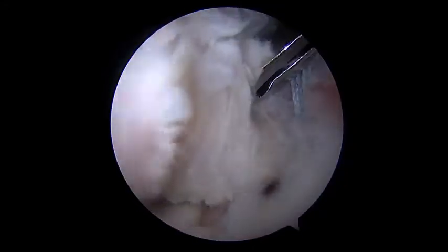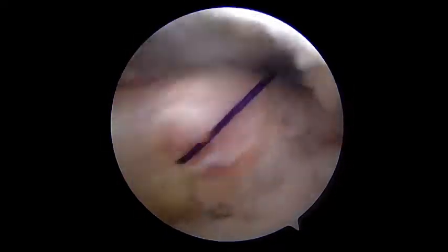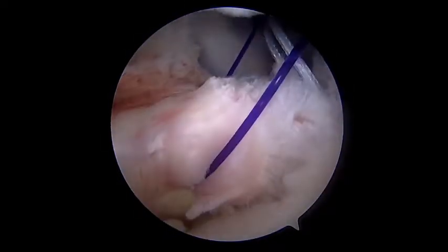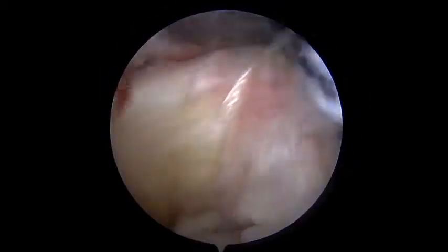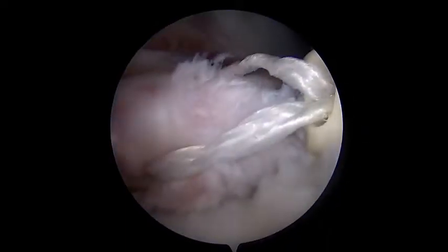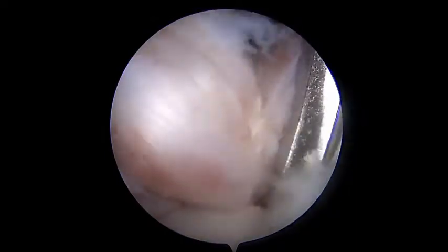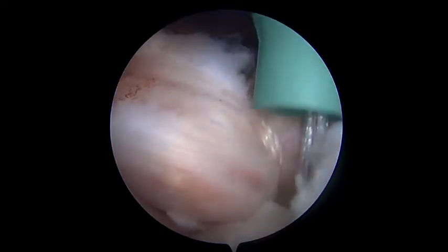This series of steps is then repeated with the superior labral suture after punching an anchor point at the junction of the superior 1/3 and inferior 2/3 of the lesser tuberosity footprint. Suture ends are cut with labral tape scissors.